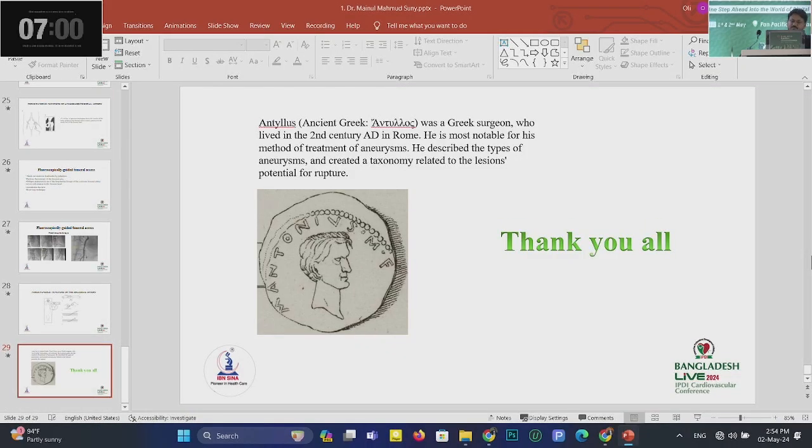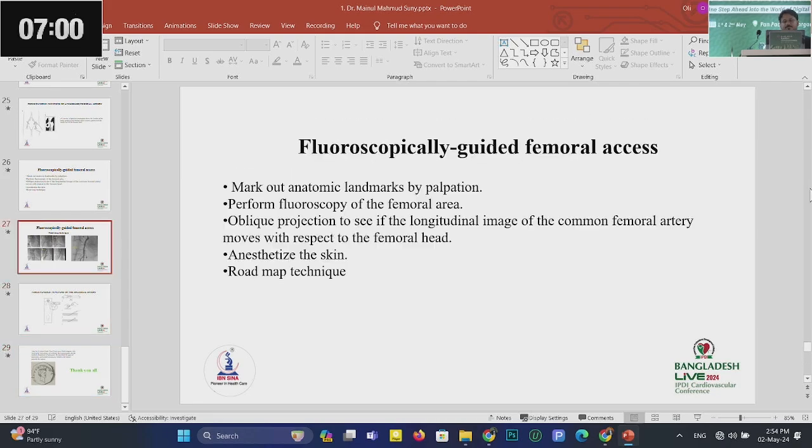So this is about the puncture, step by step. The first step is the opening door of endovascular procedure. We have different size needles here, the 18 size, and 20, 21 size wires, and hardware also. If anyone is interested, they can see, or we can show you at the end of the session.